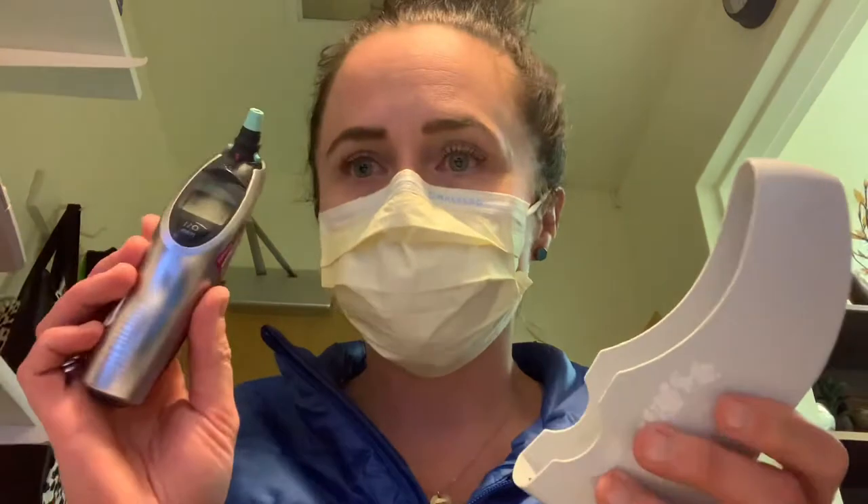A lot of places have these tympanic thermometers. Just make sure when you do use this one, it's supposed to go right in the hole in your ear. Some people's ears are shaped oddly, so you might need to kind of move it around and make sure that you're getting it inserted well into the ear to get an accurate temperature.